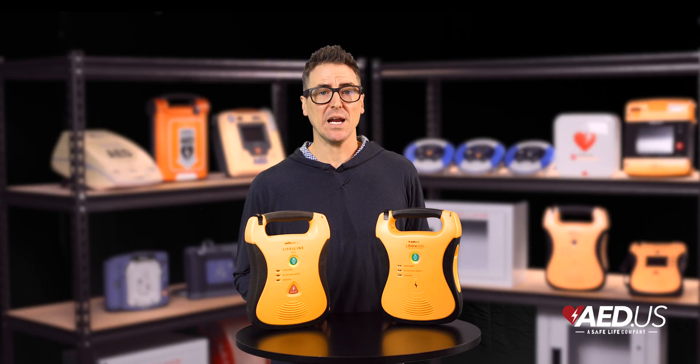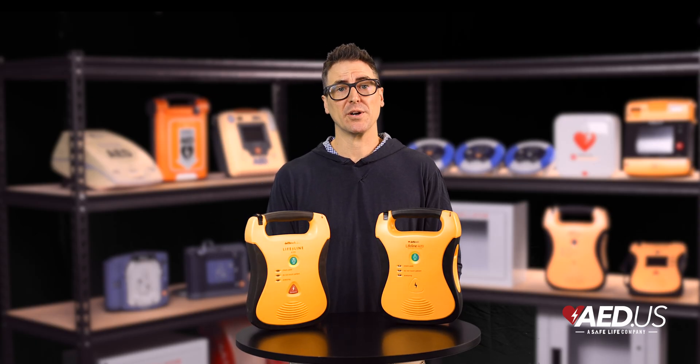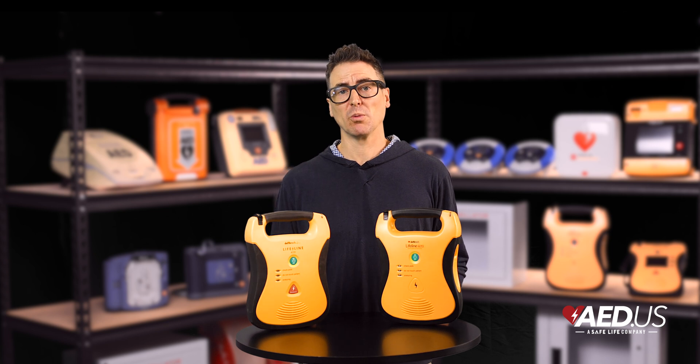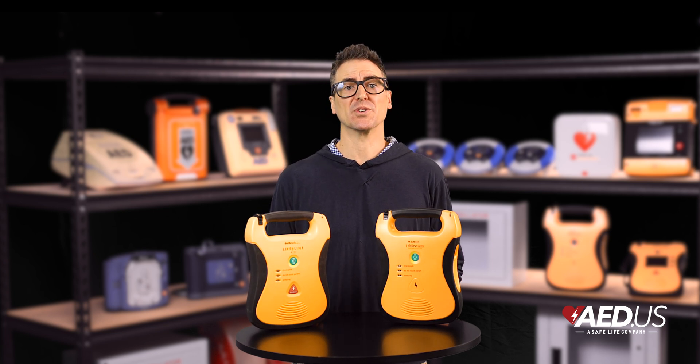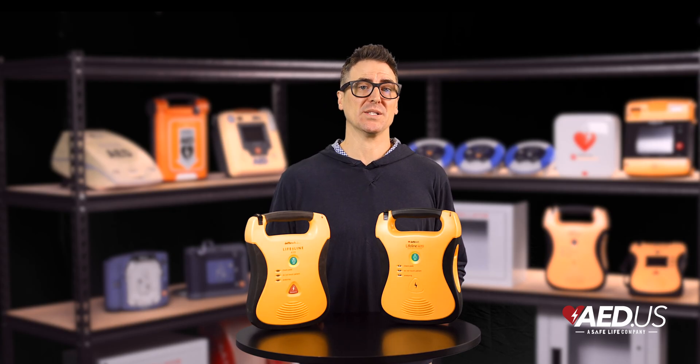In terms of ownership, the Lifeline AED is also cost effective. Replacement pads and batteries are affordable, and the combination of long-lasting consumables and dependable performance keeps the total cost of ownership low without compromising quality.